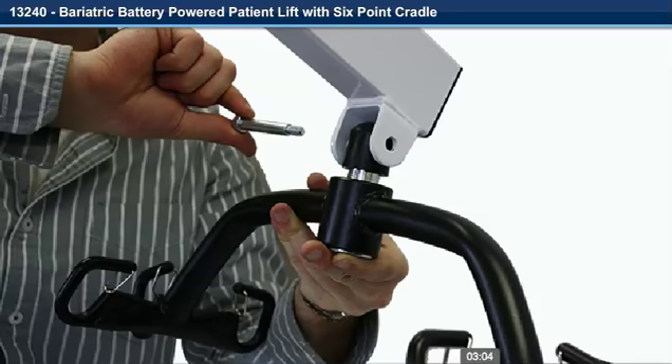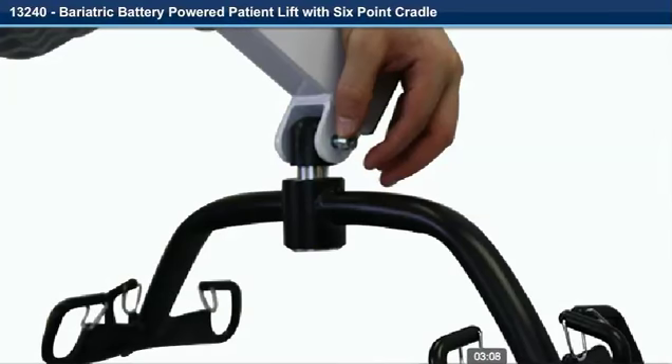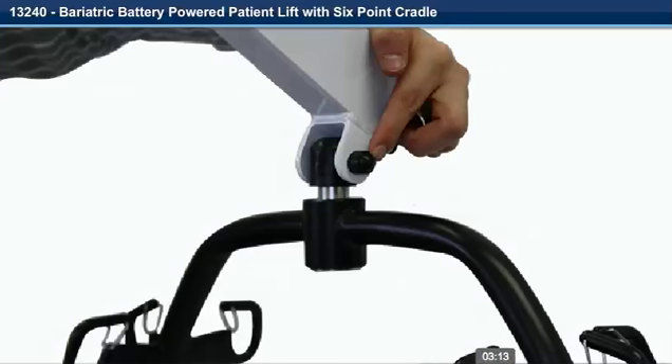Insert the bolt through the holes. Step 19. Install the nut on the bolt and tighten. Step 20. Install the nut cap on the nut.